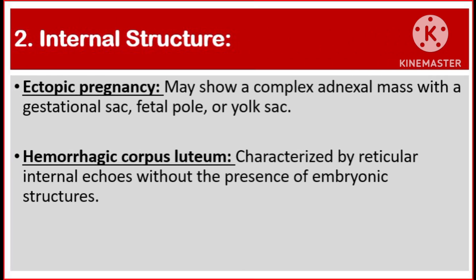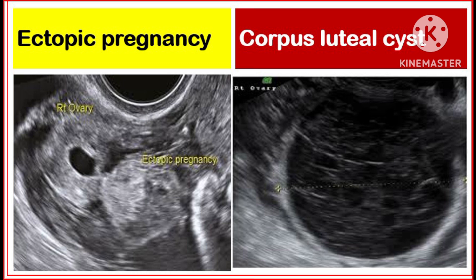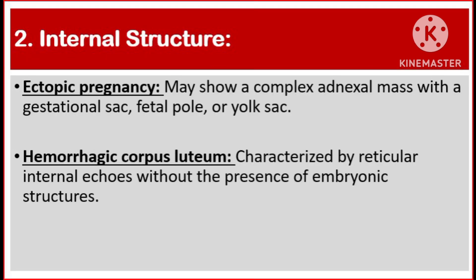Number two, internal structure. Ectopic pregnancy may show a complex adnexal mass with a gestational sac, fetal pole, or yolk sac. But hemorrhagic corpus luteum is characterized by reticular internal echoes without the presence of embryonic structures.